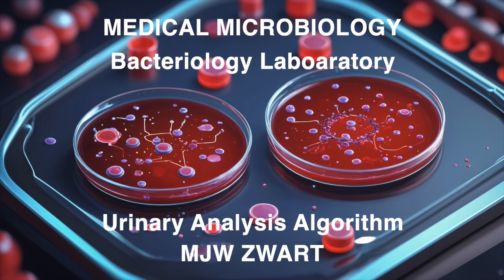And it really dives into the nitty-gritty of how to tackle urine analysis with a laser focus on UTIs. It also encourages feedback, so it's like a constantly evolving resource. Okay, let's zoom in on one of the most intriguing parts of this document. It highlights a technique used in Dutch labs called the Q-score. Have you heard of that? I have not. So it's a quick assessment using a 10x objective lens to determine if a urine sample actually needs a full workup or not.